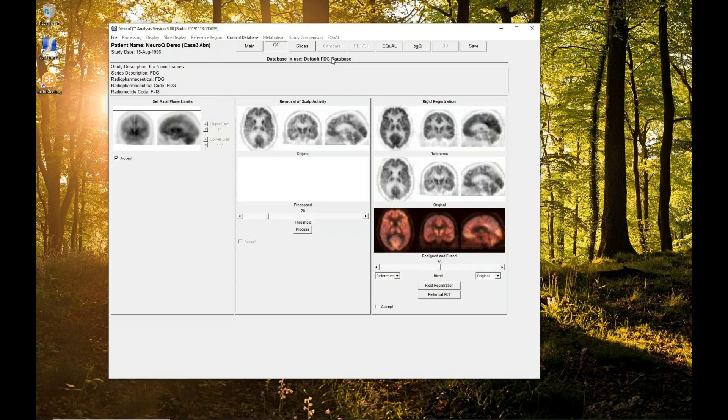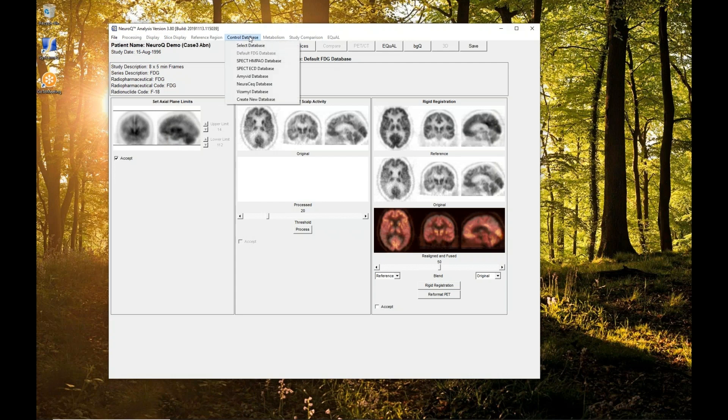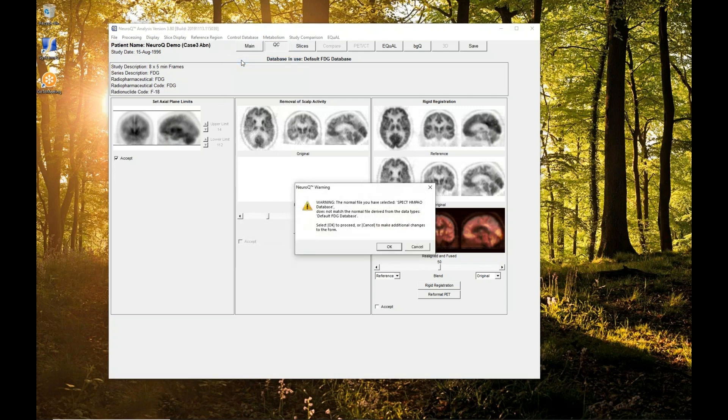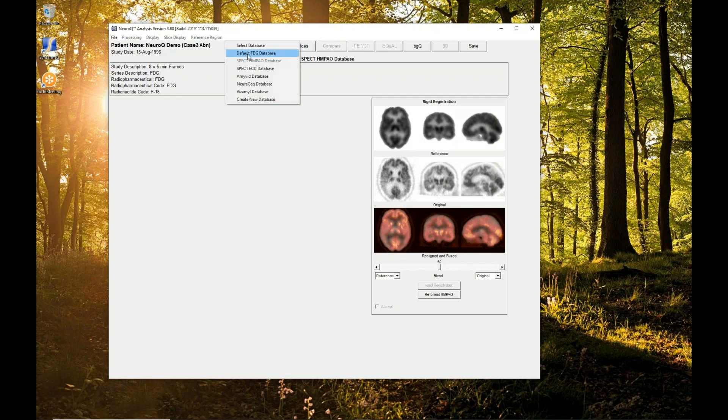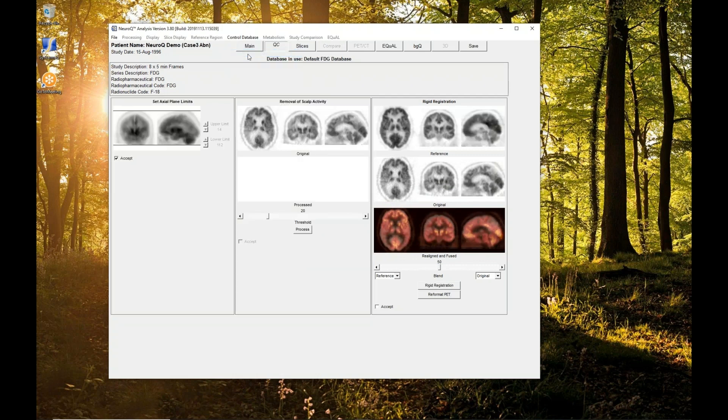If it makes a mistake, and it might, there's a drop-down control database where you can select the actual normal database. If you do that, it's going to tell you, wait, I think this is FDG. Are you sure you really want to do that? Then you can say yes, I'm really sure, and it will duly fix things. But we'll set that back to FDG.